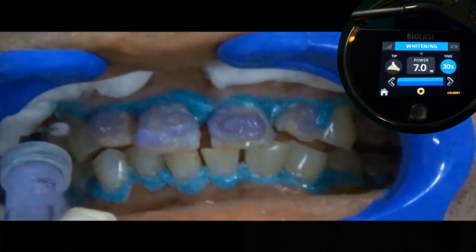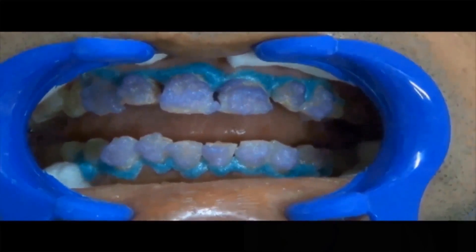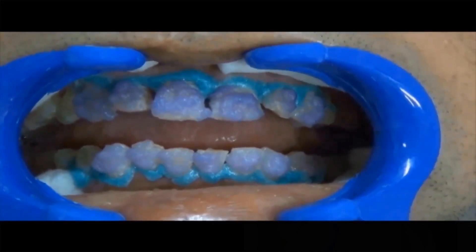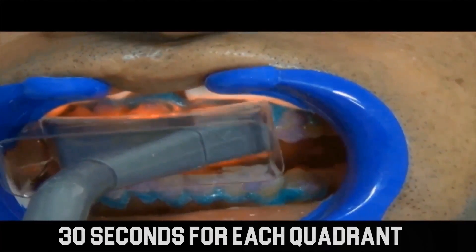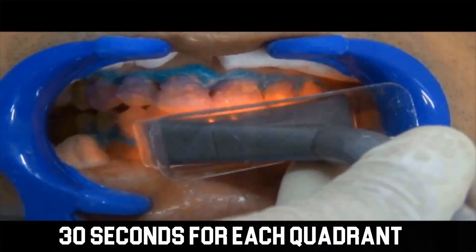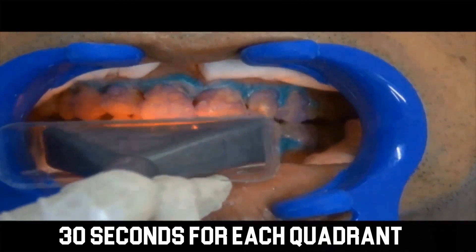Prepare the laser to 7 watts for 30 seconds in each quadrant. Apply the gel evenly on all the teeth. Place the whitening handpiece in close proximity of about 1 mm without contacting the whitening gel.